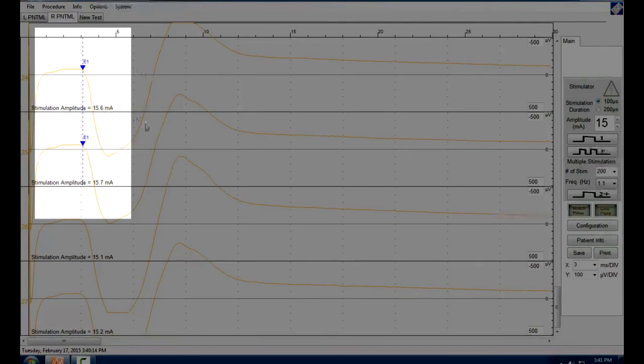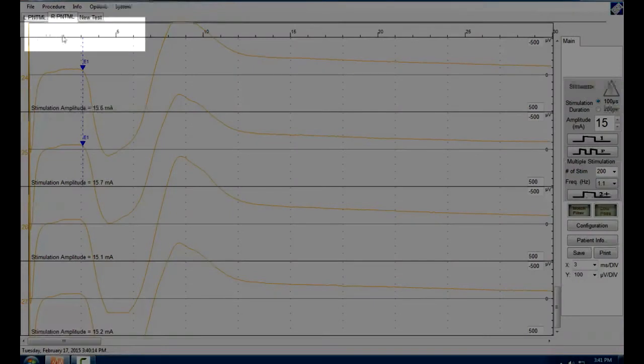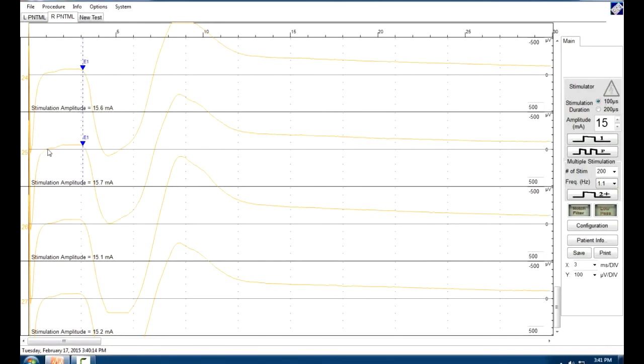Now I'll tell you that right now we are not actually stimulating a pudendal nerve. We're doing an ulnar nerve on somebody's arm. And so up here at the top, you can see these markers represent time units. And so we're at three milliseconds here. That is a little long for a pudendal nerve. Normally it's going to be closer to 2 here. But this is still the type of pattern that you're going to want to be seeing. You're looking for this plateau and then see where the nerve takes off. Essentially, once you have done both the left and the right side, you are finished.